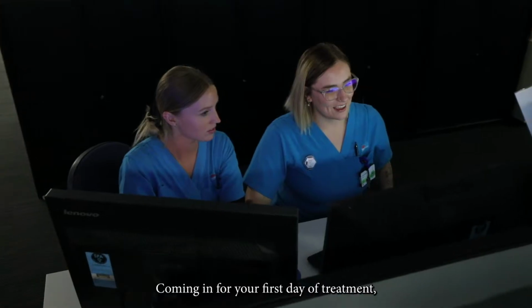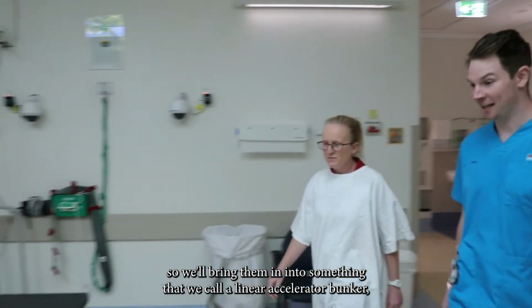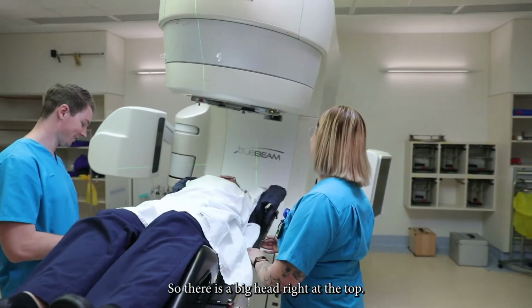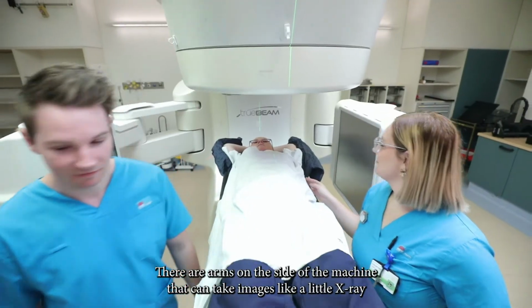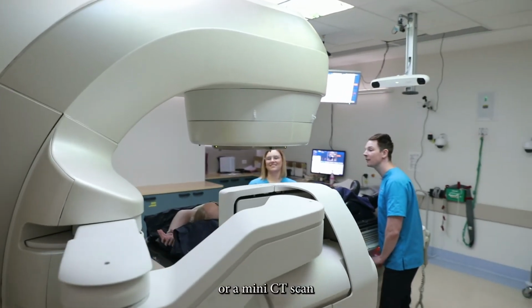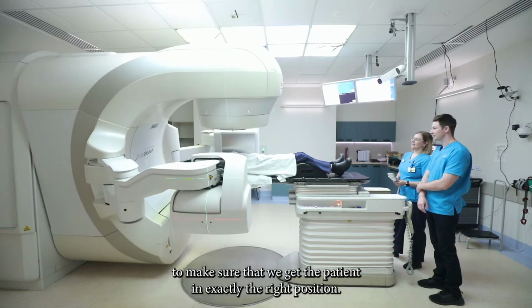Coming in for your first day of treatment, we'll bring them into something that we call our linear accelerator bunker, which is where our big machine is held. There is a big head right at the top. It produces the treatment itself and shapes the dose into exactly where we want it to occur. There are arms on the side of the machine that can take images, like a little X-ray or a mini CT scan, to make sure that we get the patient in exactly the right position.